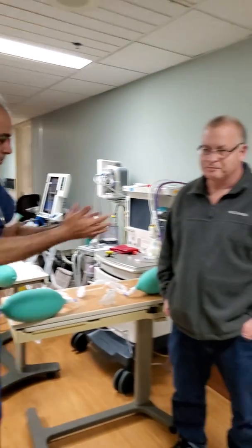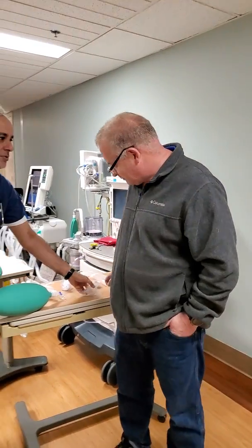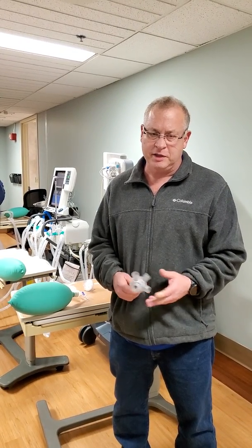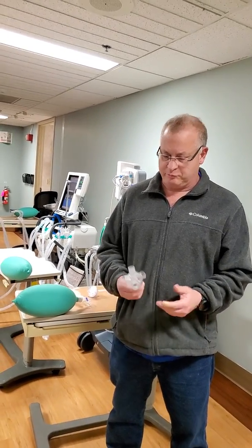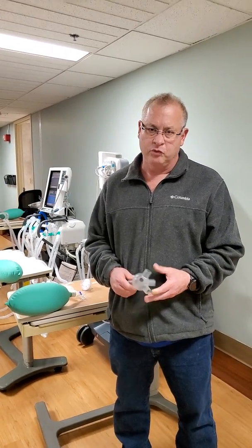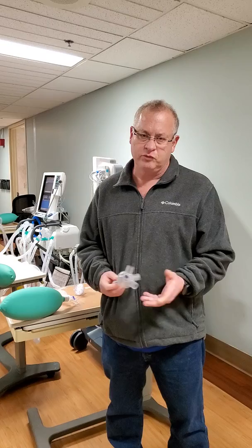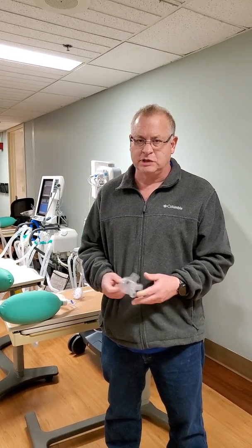I want to introduce you to Bob. Bob, tell me what you've been up to. Hi, my name is Robert Conley. I'm the owner of Interactive CAD Solutions. Less than 4 days ago, I got contacted by email if I could help out with coming up with a method of supplying 4 hoses from one ventilator to 4 people. First thing I got was a hose from the anesthesiologist, and we did our first trials yesterday. Came out with mixed reviews.